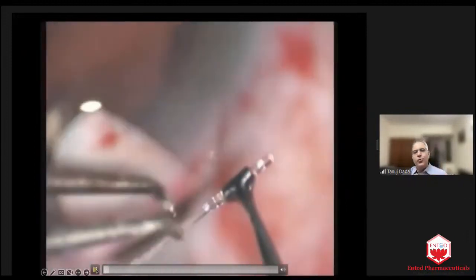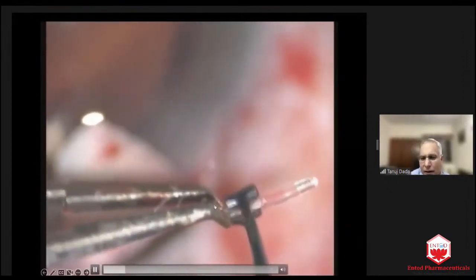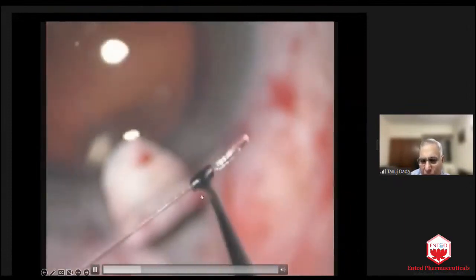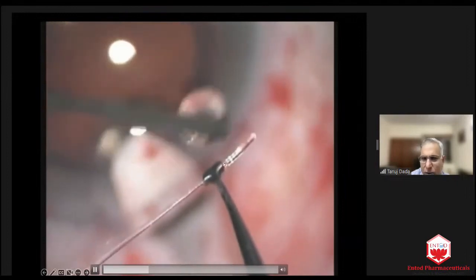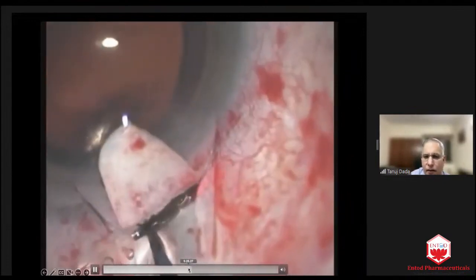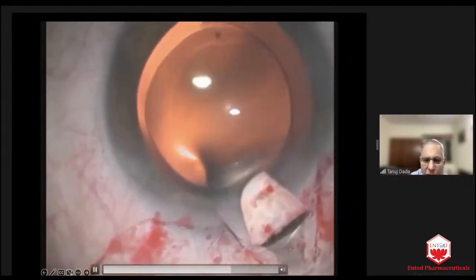And this I am showing you for primary congenital glaucoma. Nowadays, 360 degree trabeculotomy is done with an illuminated microcatheter. This microcatheter is inserted in the canal of Schlemm and goes 360 degrees. You can visualize the movement of this catheter through the gonioscope. See, now this catheter is moving through the canal of Schlemm. All these are recent advances in glaucoma surgery where you require intraoperative gonioscopy.